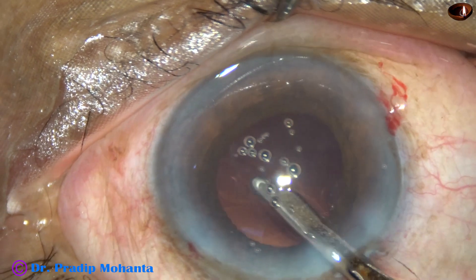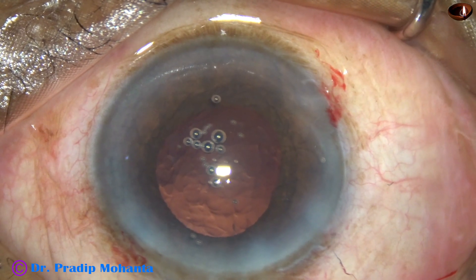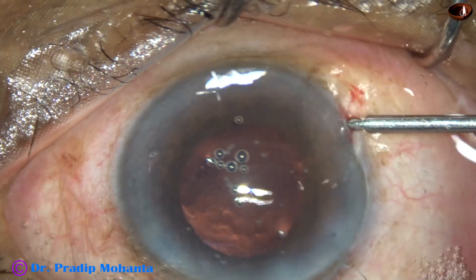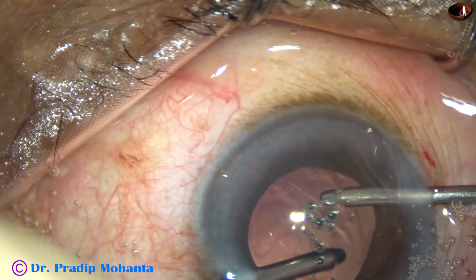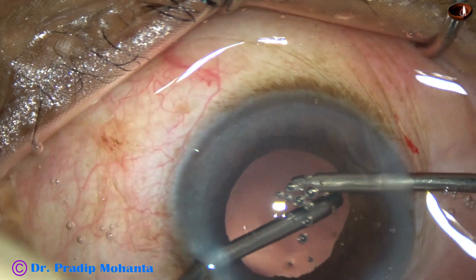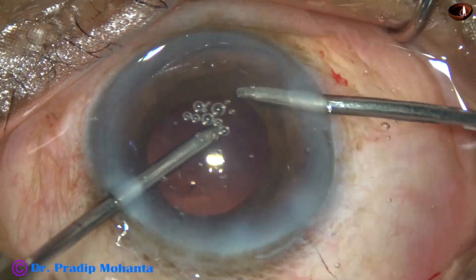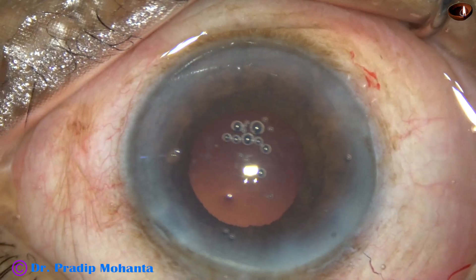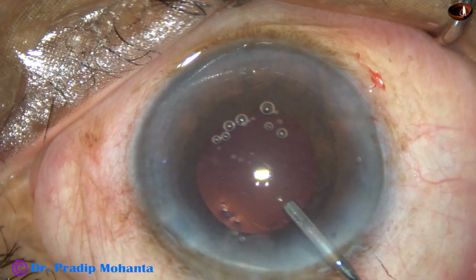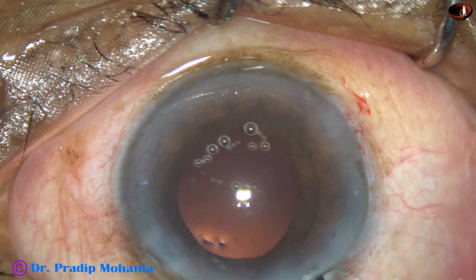Cortical cleanup is done using a 23-gauge Simcoe cannula. The sub-incisional cortex is difficult to remove with this, so for the sub-incisional cortex, bimanual irrigation-aspiration was used. You can see that the pupil is becoming small, probably because the iris is getting touched by the Simcoe as well as by the IA.